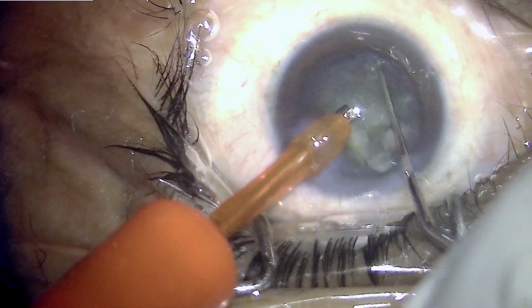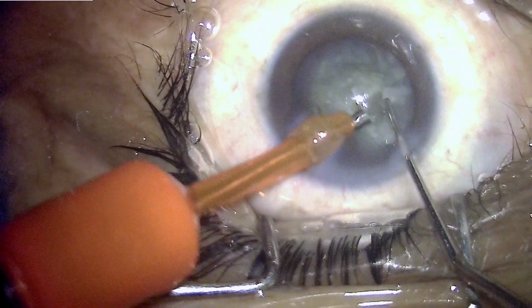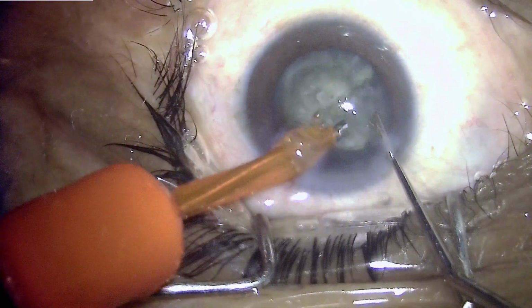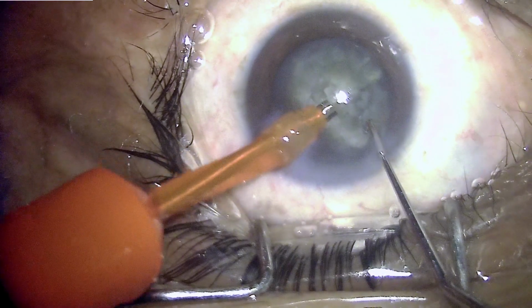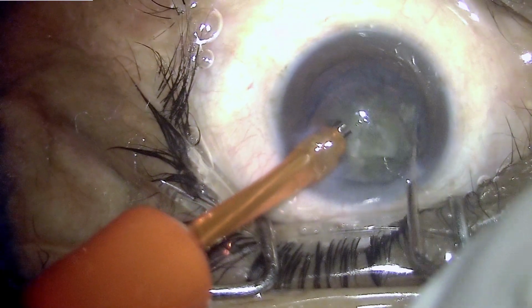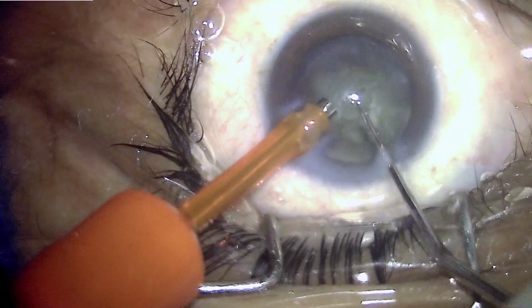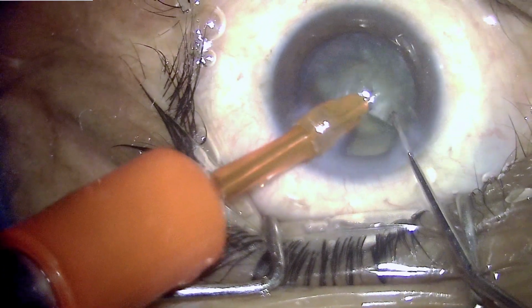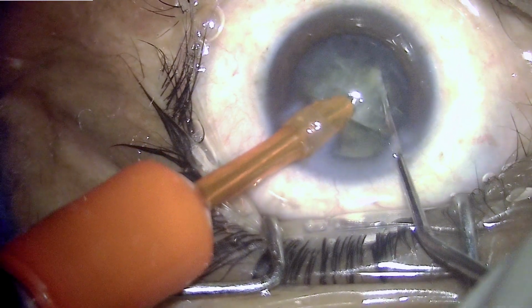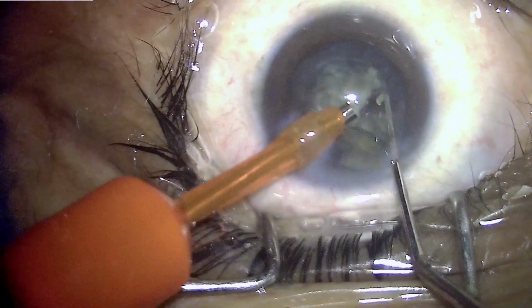However, things can go wrong at any point, and this is the delicateness and the fineness of the surgery of phacoemulsification, where things can simply go from absolutely normal proceedings to some amount of complication, and that is why this surgery has a significantly steep learning curve.